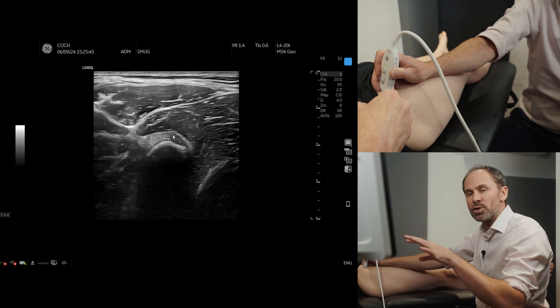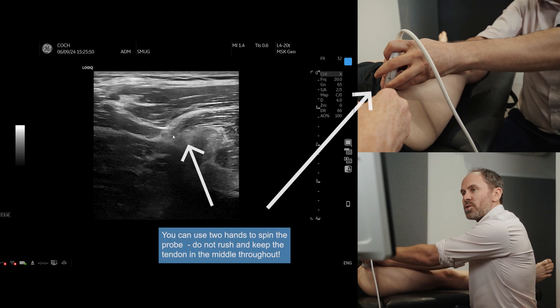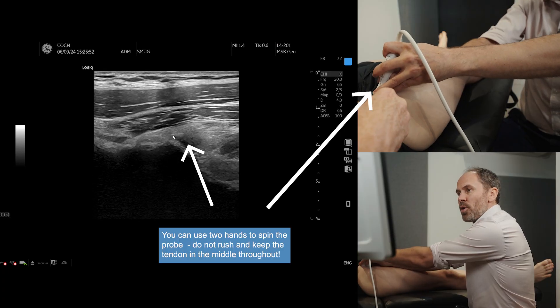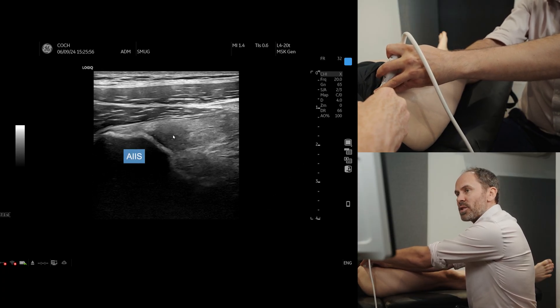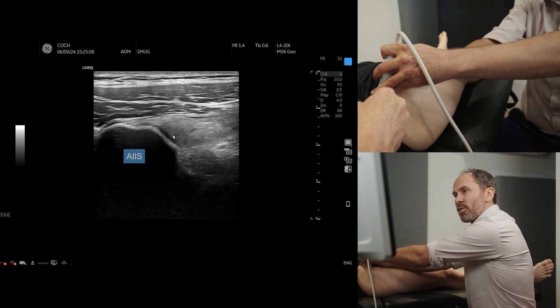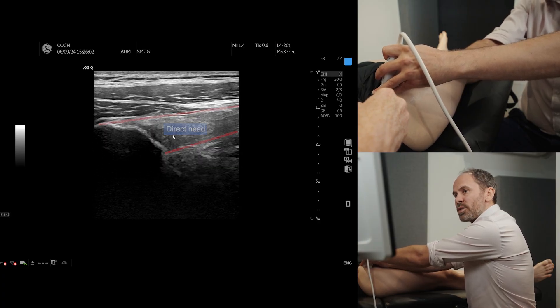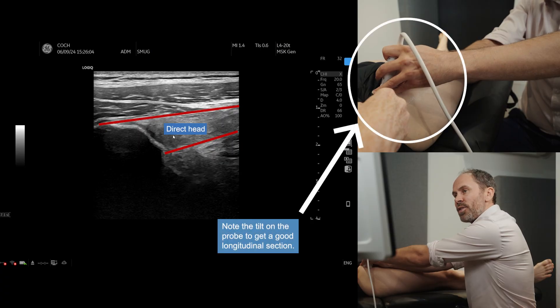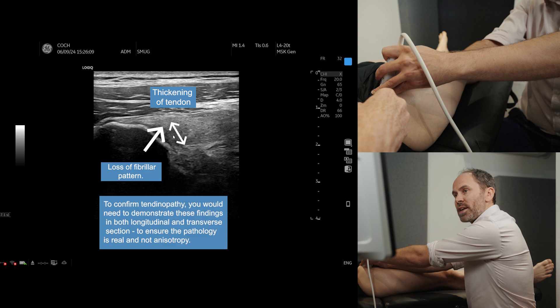So do have a look at that in transverse section, but we do want to see it in long section as well. To do that, we can just spin with our probe, and you can see that's the AIIS, and then just coming off to the right of that is the direct head of REC-FEM. You may just need to toe down your probe a little bit, and you can see here that there is a loss of fibrillar pattern, so there is some mild thickening of this direct head.